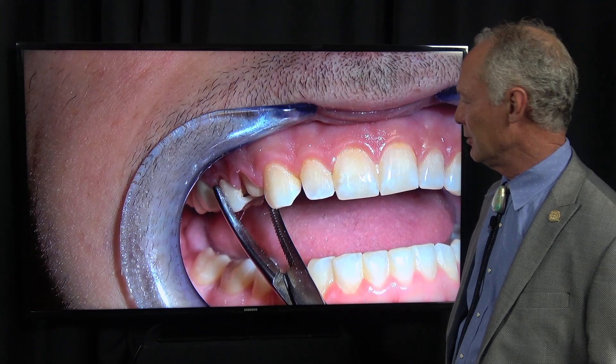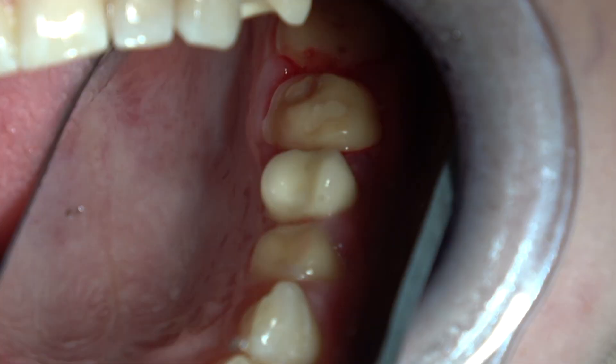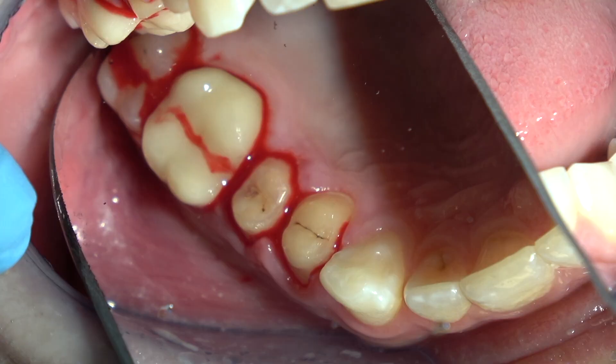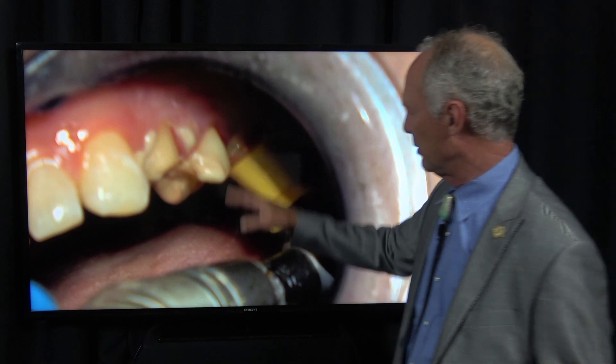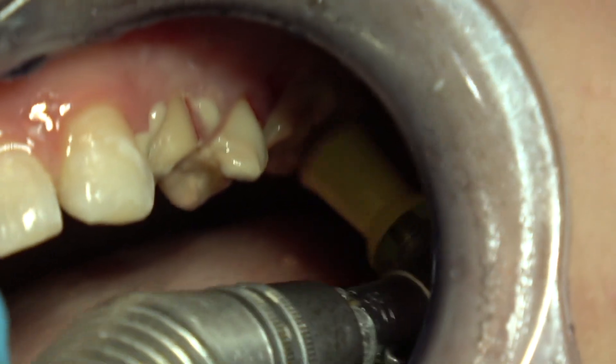If they're not sensitive, you may not need to anesthetize the teeth. On the one side we've got crown, crown. On the other side we've got two crowns. On the posterior teeth, you can see how inflamed and bleeding the gingival tissue is.